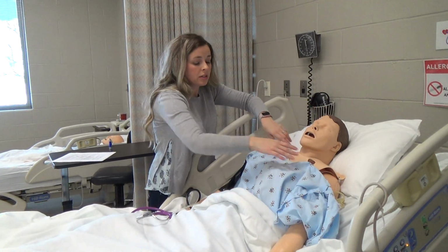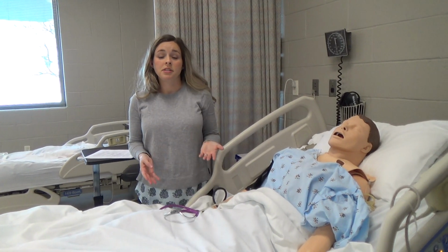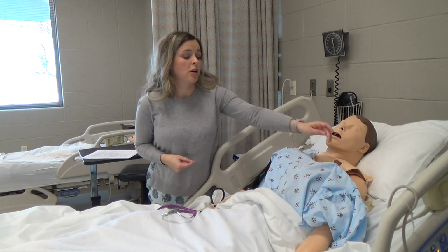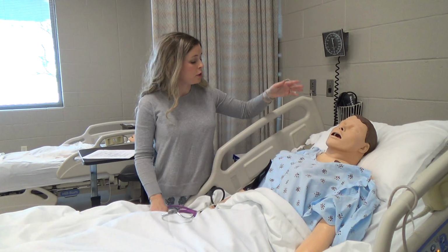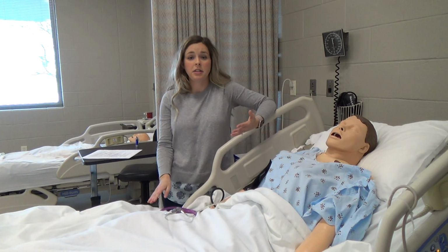So when I'm listening for lung sounds, I want to see if they're clear, or if I hear any sort of adventitious sounds, such as crackles, rhonchi, wheezing. Those are abnormal sounds. I'd also want to ask the patient about their cough. Have you been coughing at all lately, Miss Gray? And she tells me no.